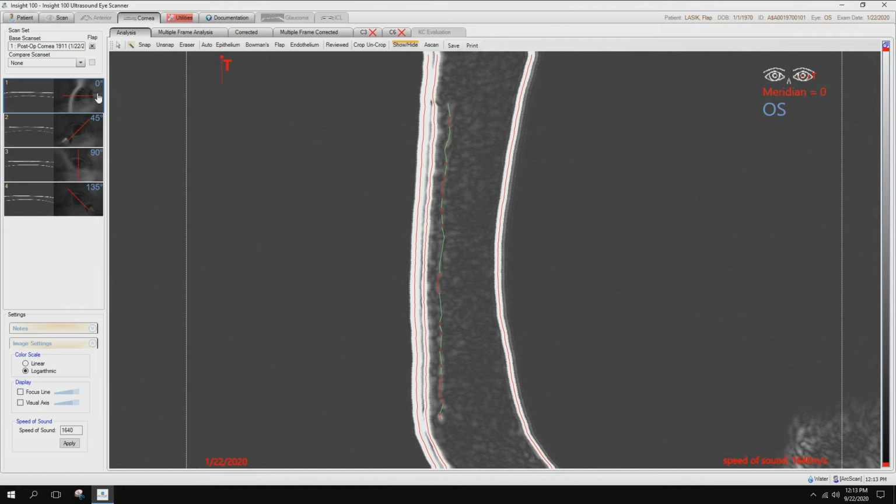We've taken multiple meridian scans of the cornea: 0, 45, here's a vertical scan, and here's the 135 scan. So there's each of them here. This represents nearly 10 millimeters of cornea exposure. The reason this is not a perfect curve that you're used to seeing is the patient leaning in and out, maybe even taking a breath. This is microns of movement. The ultrasound is keeping up with it so that you have consistency of the measurements throughout.